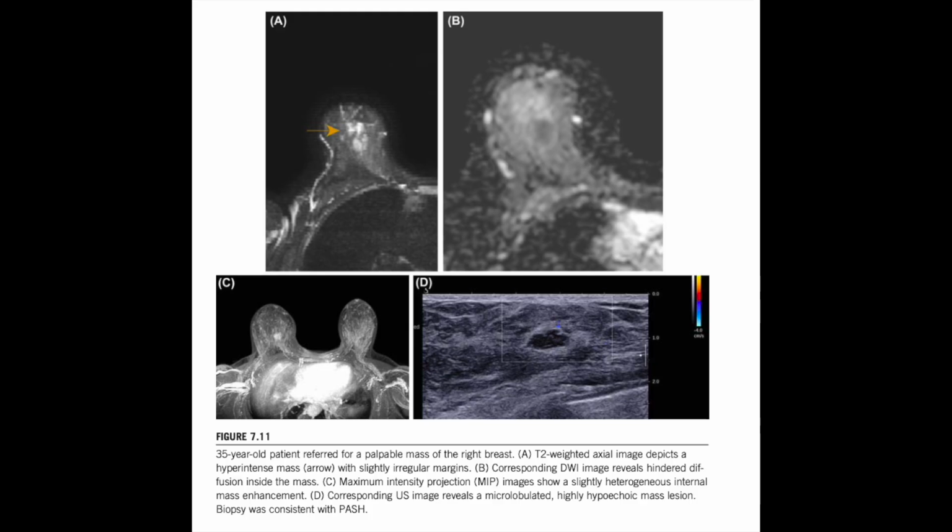Why does it trick the MRI? What's the biology behind that? It's all in the name. Mucinous. The tumor produces huge amounts of sticky, gelatinous mucin. Like a jelly. Exactly, and the contrast agent needs to diffuse through the tissue, but this mucin is like thick honey. It physically slows down the contrast. It gets bogged down. So that classic washout signature of malignancy it never appears. It's a biological ambush. Let's shift gears to follow-up care.